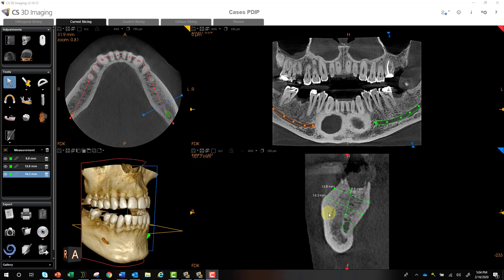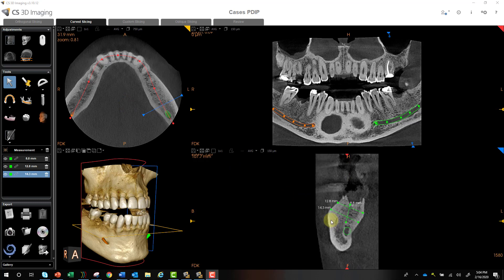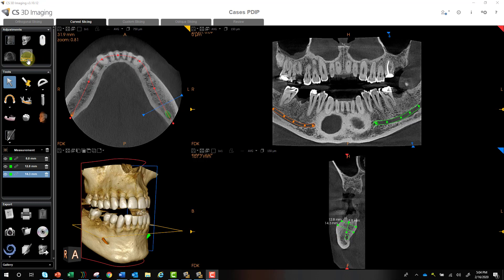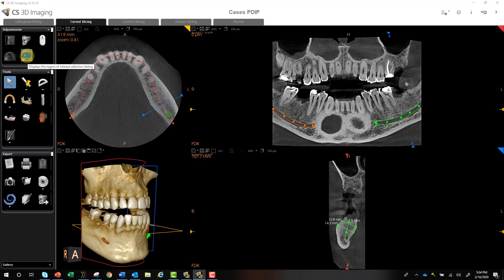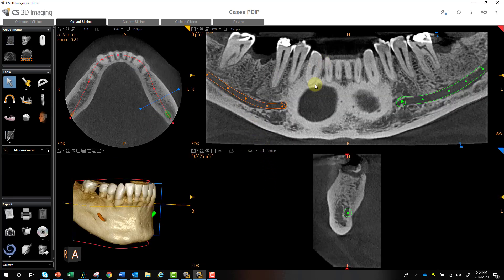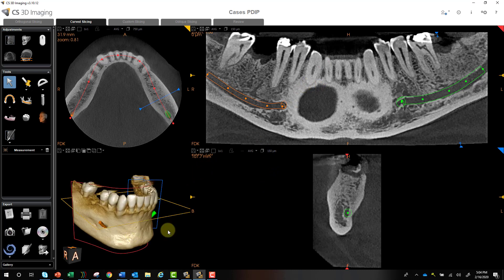You can see that I'm zoomed in on the cross-sectionals below — let's zoom back out. Another way to zoom in on that area is under the curve slicing tab. There's a little icon called the region of interest tool. Select that and you can crop out the maxilla, select okay, and it removes the maxilla from all of your views, giving you a larger canvas to work in — making it easier and more accurate.